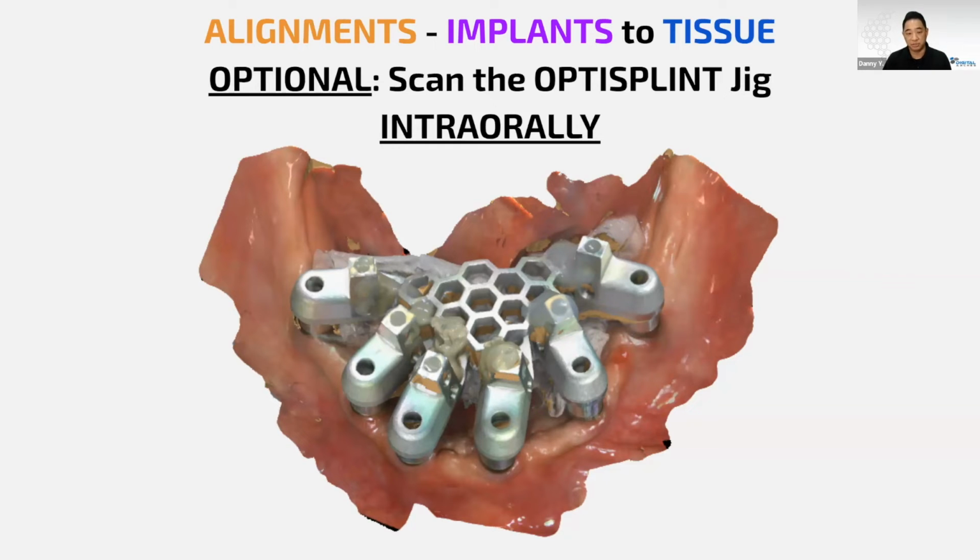Do you really need the tissue that's underneath the frame? Possibly if there's something specific you want to do with that prosthesis. On a lower, probably not, but having it here like this would probably give you plenty of data in order to pull that tissue in. That way you can actually scan the tissue just by itself and even separately and pull the tissue in if you want to. But this is an alignment scan. This is not a scan that we would recommend using to indicate dental implant positions in your design.